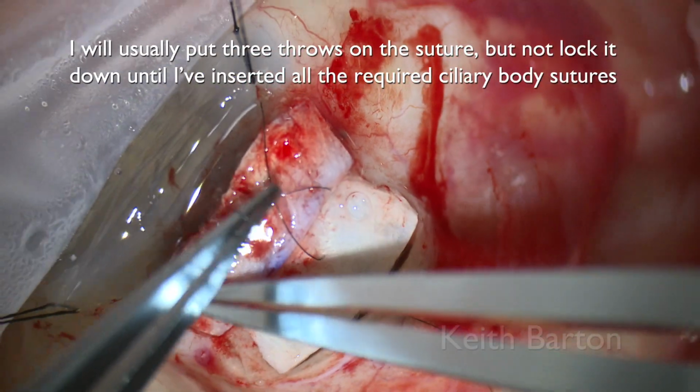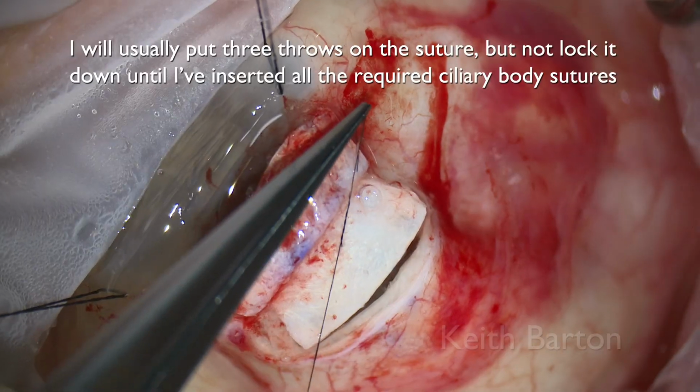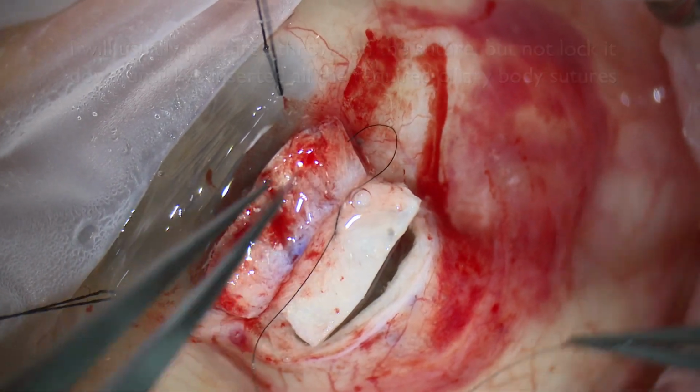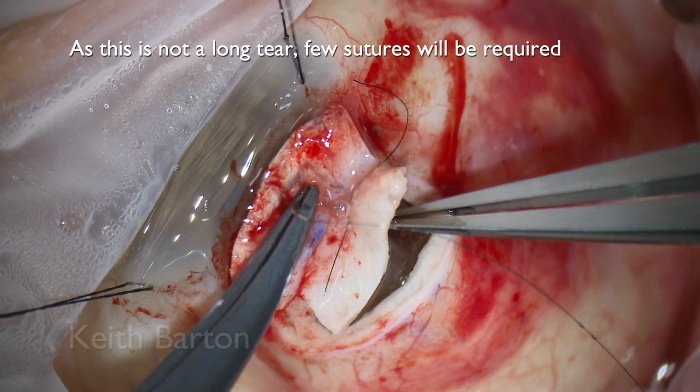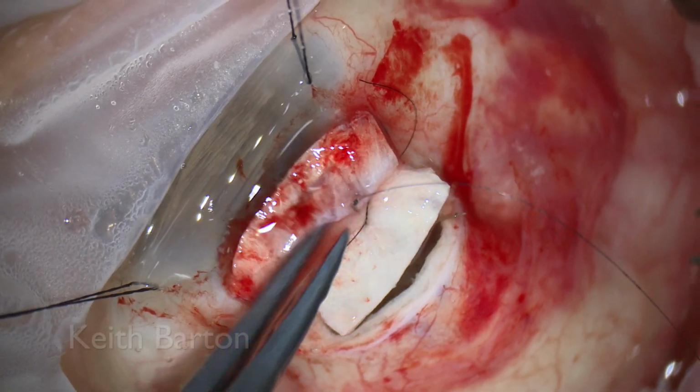I will usually put 3 throws on the suture but not lock it down until I've inserted all the required ciliary body sutures. As this is not a long tear, few sutures will be required.